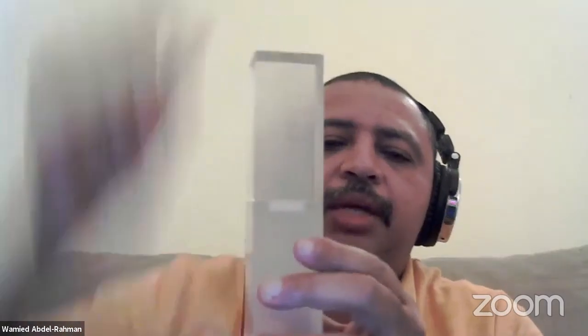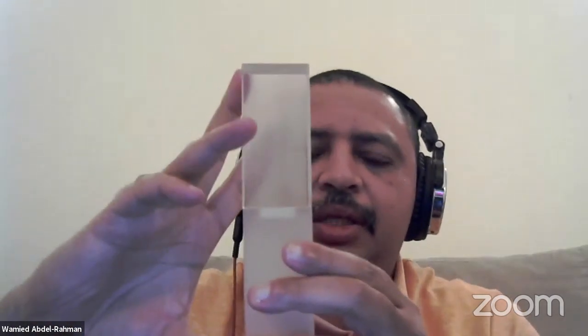I don't know where that piece of film is now, but usually, the film we will place it here, and then this piece we can place on top of it. This is about 20 centimeters.